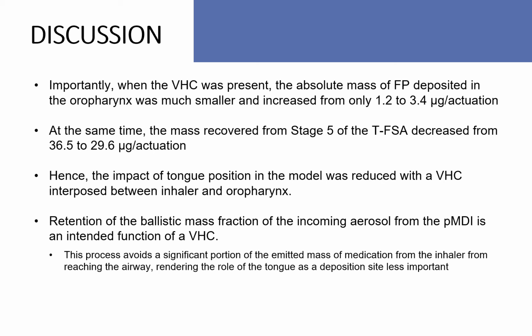Overall, the impact of tongue position in the model is mitigated by the presence of the spacer when it's interposed between the inhaler and the oropharynx. Retaining this ballistic fraction from the MDI is the intended function of the VHC or spacer. So this process avoids a significant portion of the emitted mass from the inhaler reaching the airway, rendering the role of the tongue as a site of deposition less important.